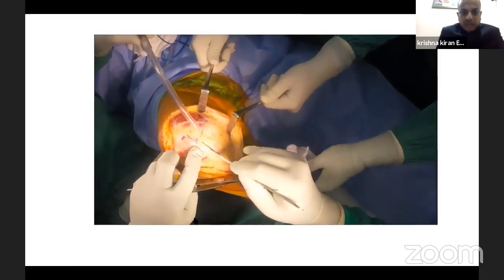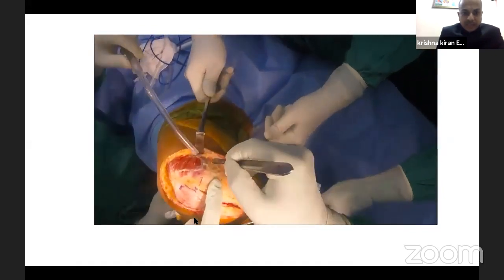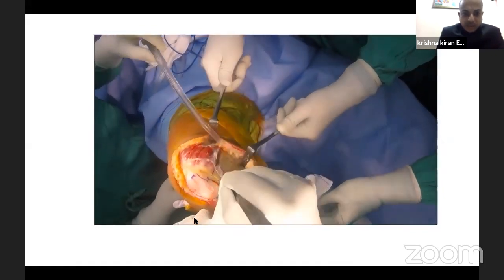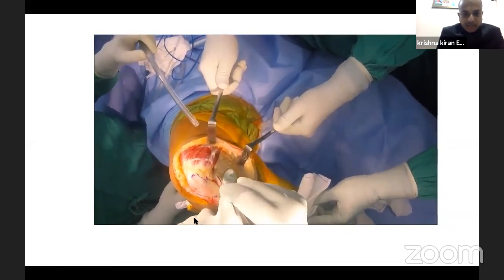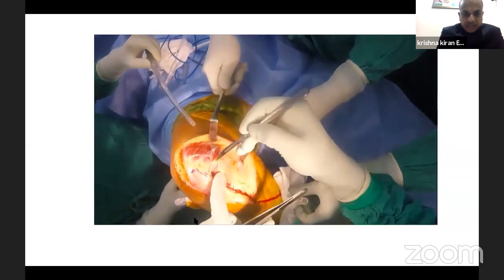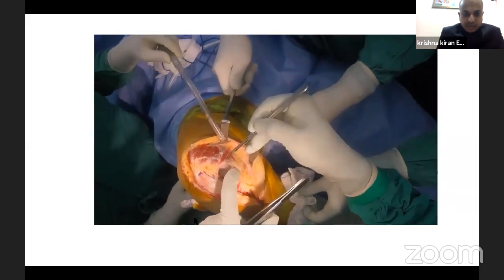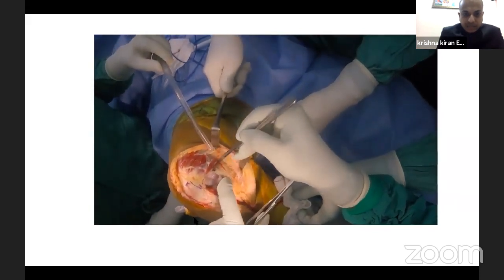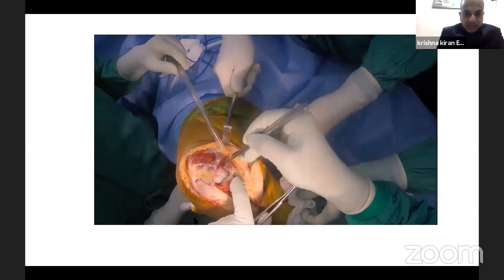We identify the VMO insertion onto the patella, and there are three types of insertion: high insertion, intermediate, and low insertion. We do an L-shaped capsulotomy and just subluxate the patella out of the way. The initial arthrotomy is done in flexion of 90 degrees, where we do the L capsulotomy, and then the inferior part of the operation is similar to that of a standard medial parapatellar approach.